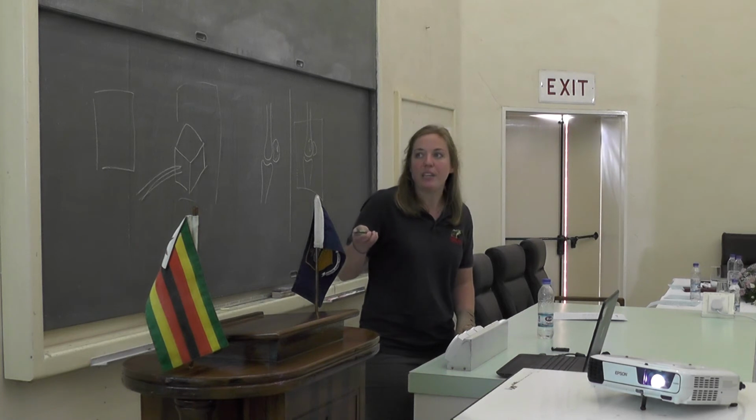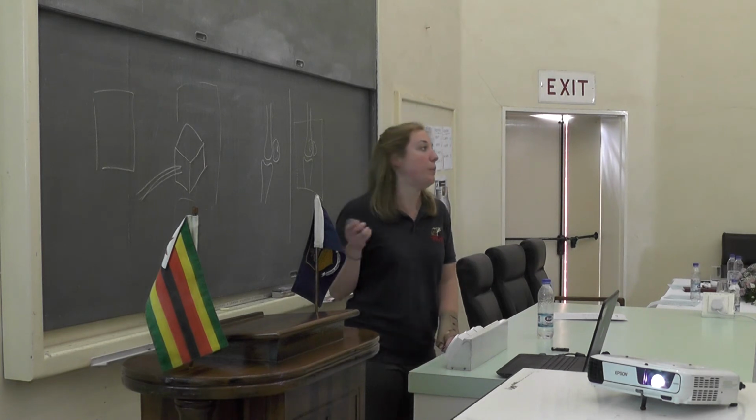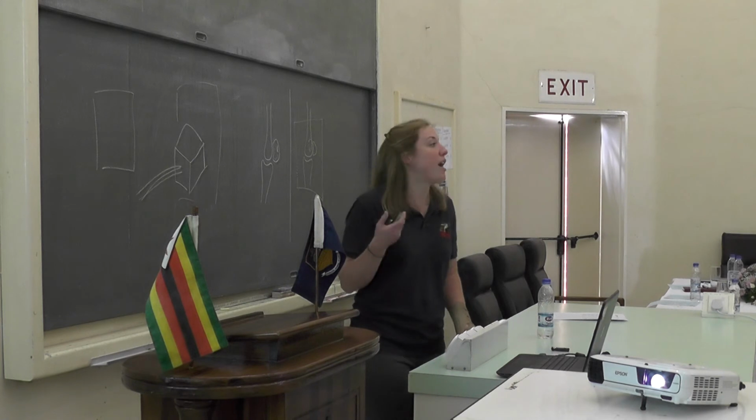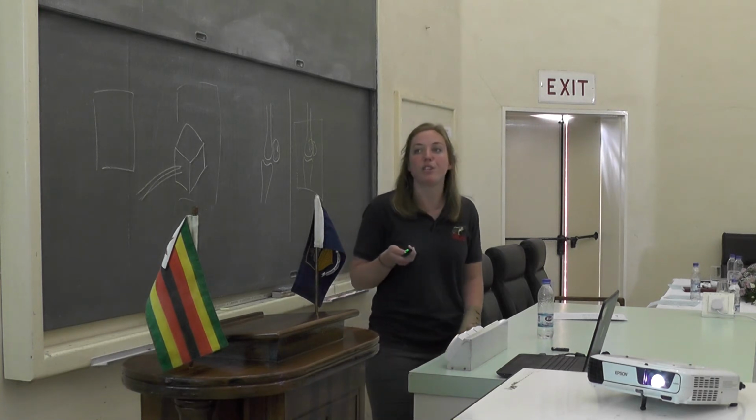Depending on the angle you use, you highlight different rows of the carpal bones, which might be just what you need to pick up some fractures, if the animal falls on their knees, or racehorses get slab fractures a lot, for example. You might just need one of these funky views to highlight it.